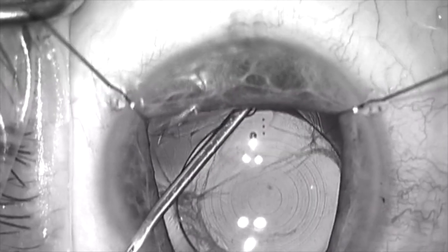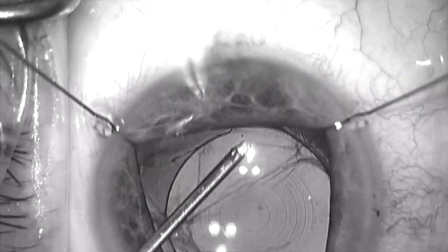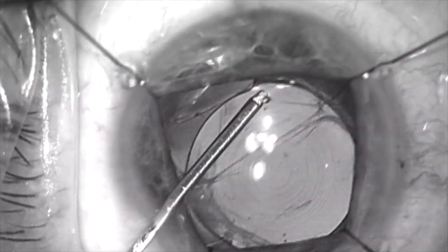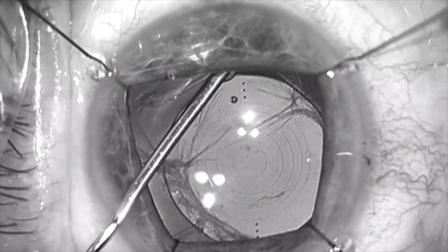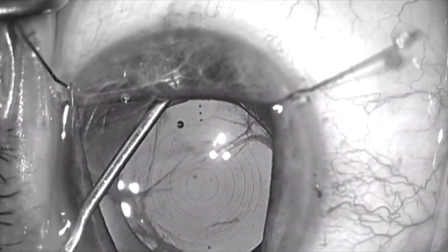Here we are going under the anterior capsule rim with viscoelastic, which is being injected through a LASIK cannula with a spatulated tip. I've identified the anterior capsule flap that is going out radial at 6 o'clock.